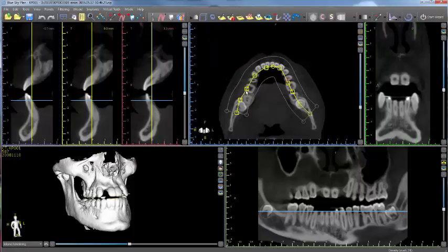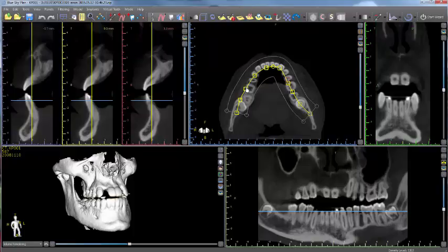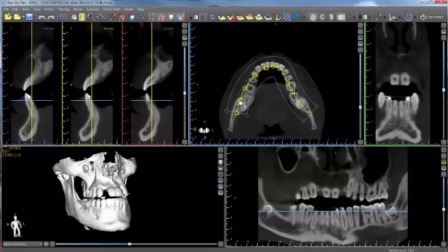The panoramic curve can be modified by dragging any of the yellow square control points to adjust the curve's shape and position. The shape and positioning of the panoramic curve affects the panoramic view (bottom right) and cross sections view (top left), which are compiled based on the panoramic curve. This is very useful in trying to emphasize structures such as the mandibular nerves.